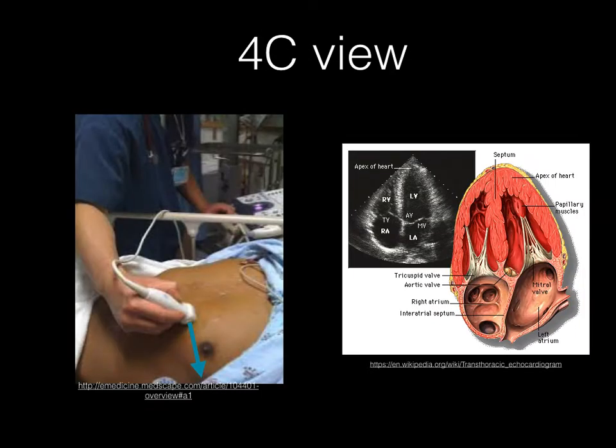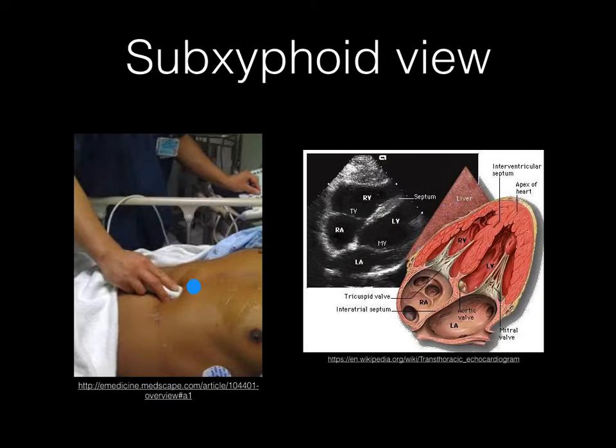The four chambers view will be generated by moving your probe towards the apex of the heart, marker pointing towards the patient's left side. Your image is going to show all four cavities, including both atria and both ventricles. The subcostal view will be generated by moving the probe just below the xiphoid process pointing towards the heart.